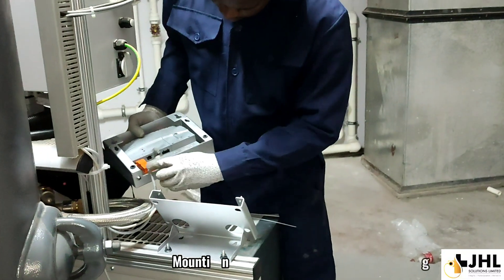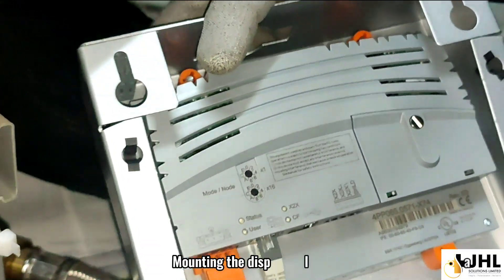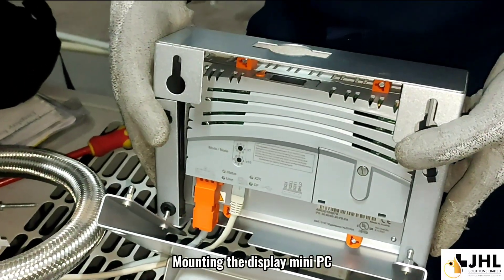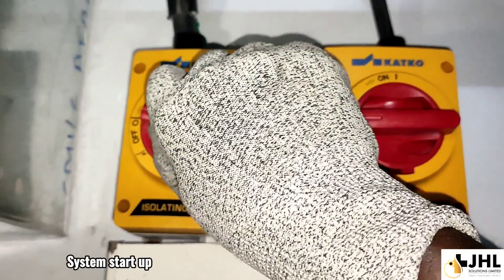Mounting the display mini PC. System startup.